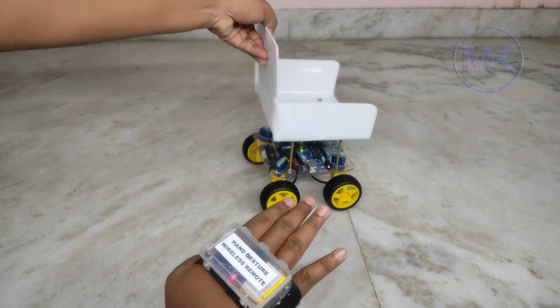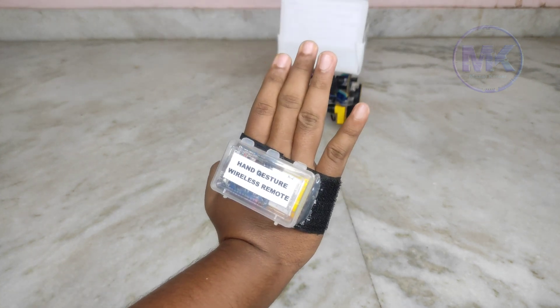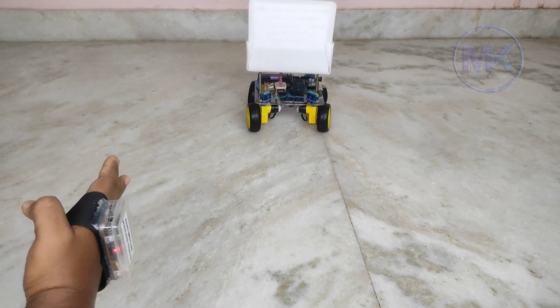Now I am going to move this wheelchair using only my hand gestures. See that the wheelchair is moving forward, backward, as well as left and right.